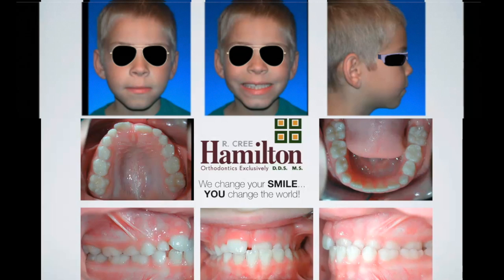What's that? The other way, right? Like kind of way left, right? Like half of a tooth left almost. Okay. And does that add up with our crossbite? Does that make sense that it would be left? It does, right? You have a left crossbite. It's probably going to shift to the left, right? So this adds up and makes sense.